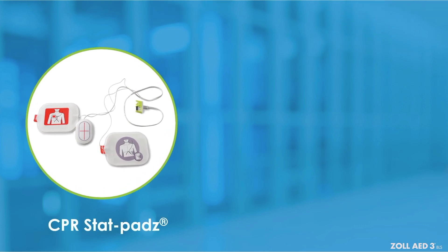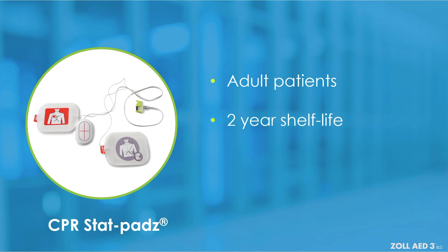CPR STAT pads are intended for use with adult patients and have a shelf life of two years. These pads include a CPR sensor that provides compression data to the AED on CPR rate and depth.